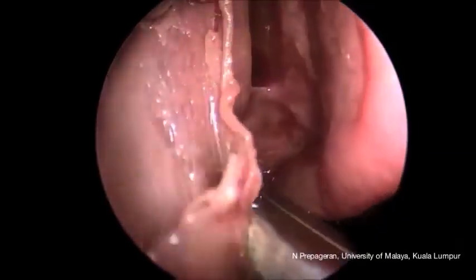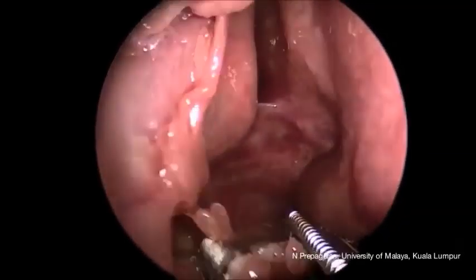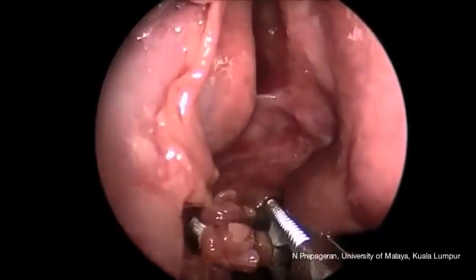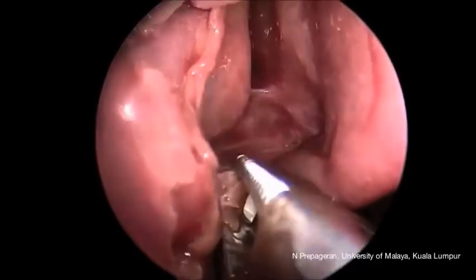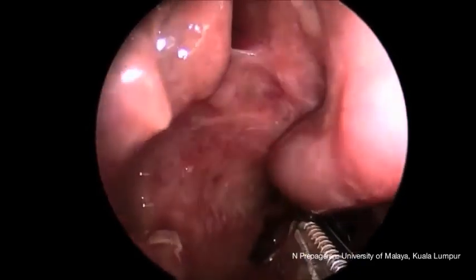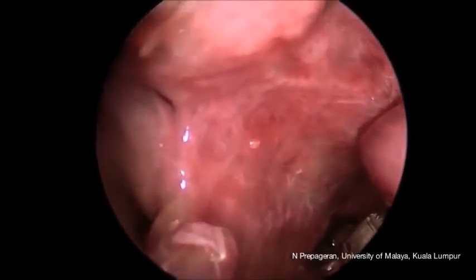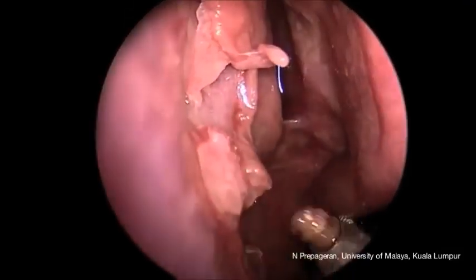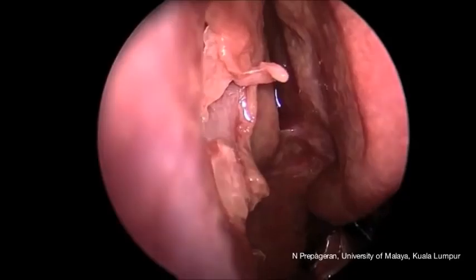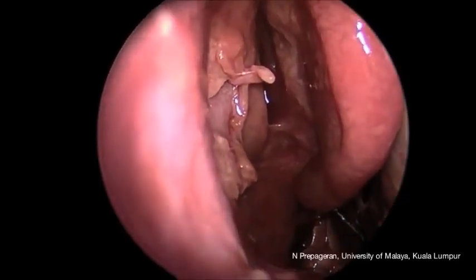Then you can actually do a retrograde uncinectomy by using a backbiter, and you want to remove the inferior portion of the uncinate process as cleanly and as much as you can, because the minute you are able to remove the inferior portion of the uncinate process, you'll be able to have a good look at the maxillary ostia, as I showed you just now.